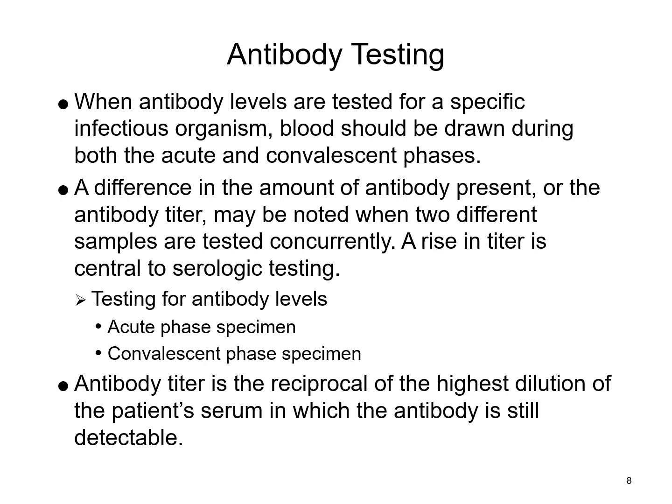When you do that serial dilution and test at those different concentrations, the antibody titer itself is going to be the reciprocal of the highest dilution of that patient's serum in which the antibody is still detectable. So our last positive result in that titer. If you have a patient that reacts at 1 to 2, but not at the next dilution of 1 to 4, then they would be considered a 1 to 2. But if you were to test them a couple weeks later and they were at 1 to 4 instead of 1 to 2, then we know that there was a rise.